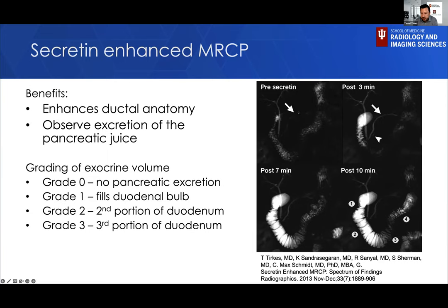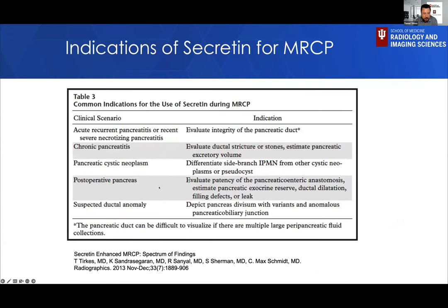This is a pre-secretin image of the main pancreatic duct. Three minutes after the secretin, you see a better visualization of the main pancreatic duct and excretion of the fluid into the duodenal lumen. We published the indications of secretin in 2013 in this journal.